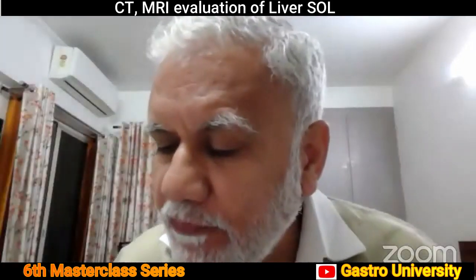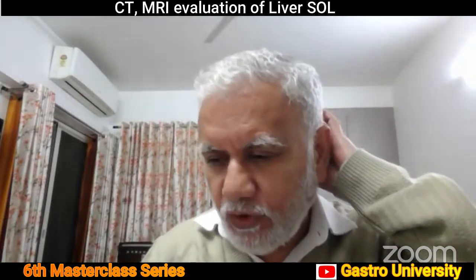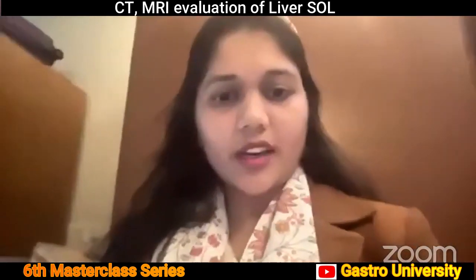One more minute, Sanyukta. If we have to further investigate after an ultrasound, what would you prefer? If available, contrast enhanced ultrasound, a triple phase CT, or a contrast enhanced MRI? So in the cystic lesions? No, whatever lesion we have seen on, let's talk of solid because cystic is a little easier. Solid lesion on ultrasound, we want further investigation. What is the choice further? The MRI, as per the studies, this is more sensitive. We tend to take more dynamic phases, and the lesion characteristics can be identified more easily on MRI.